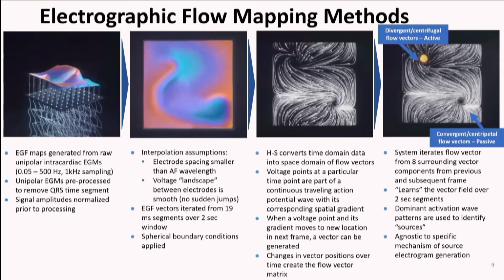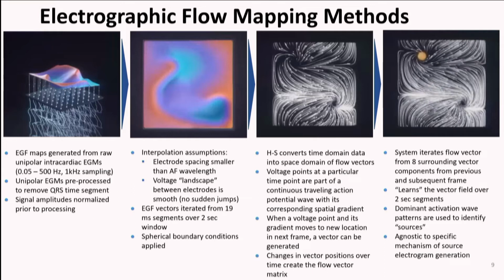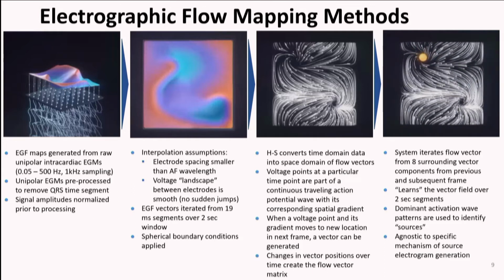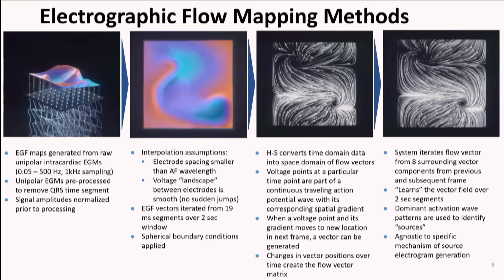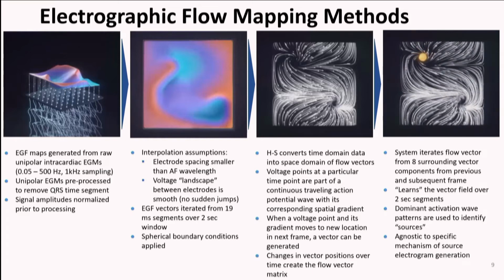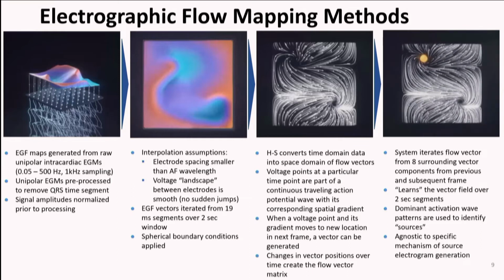So let's just take a look at an example. Oh, and actually, this is another important thing. If you look right here, for example, where you see the yellow dot, all the flow is heading away from that. So that is potentially a source. On the other hand, if you look at the bottom, you see flow heading toward that location. I'm going to play that one more time. So that looks like a passive rotor. If activation is going toward it, then that can't be something that's driving this activity.